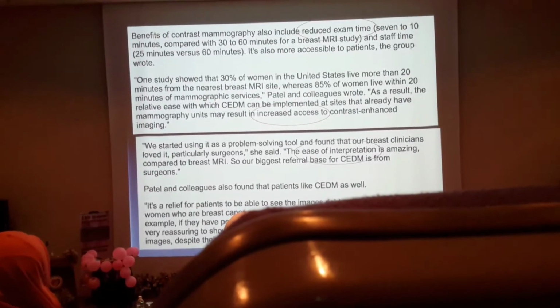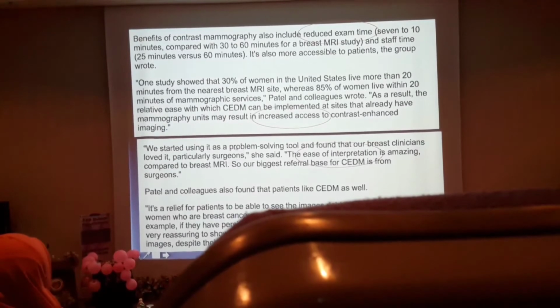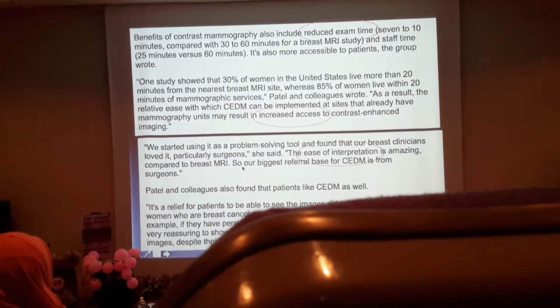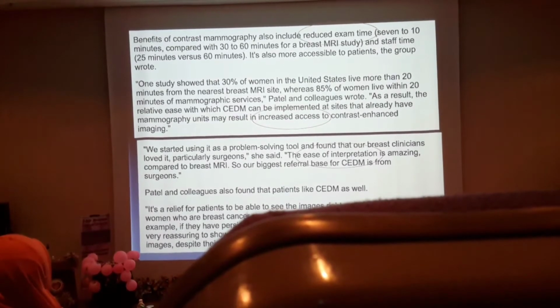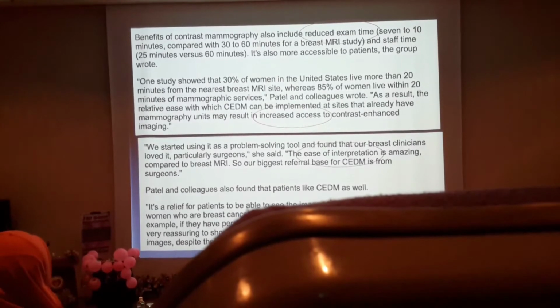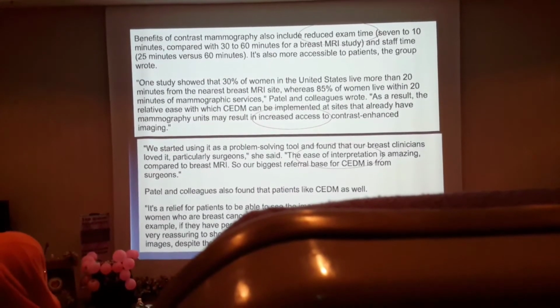And the surgeons, if you see this line, they found that the breast clinicians, particularly the surgeons, really liked it because of the ease of interpretation. You can see the lesion is either there or not there. So it's not like an MRI, where sometimes you have to differentiate between the benign lesions and the malignant lesions. Yes, benign lesions do enhance, but this one is usually quite straightforward.